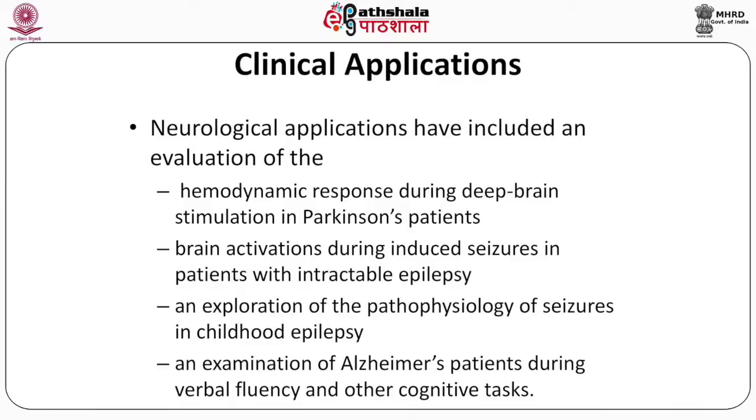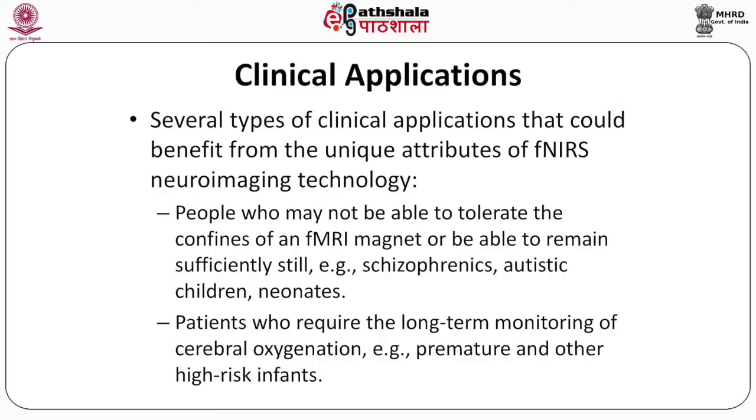Also, we evaluate the exploration of the pathophysiology of seizures, in particular childhood epilepsy. Examination of Alzheimer's patients during verbal fluency and other cognitive tasks has also been done using this functional near infrared spectroscopy. Continuing with the clinical application, there are some more clinical applications.